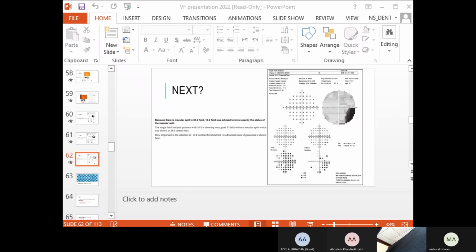Okay. So, what's your impression? What you will do? Where? Why do you want to confirm that? Is it a glaucoma? This one. Do you want to see the other eye? Yes.